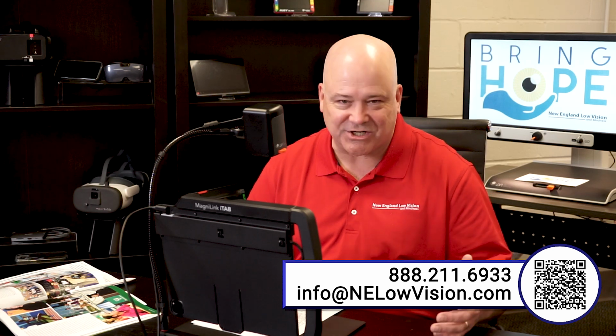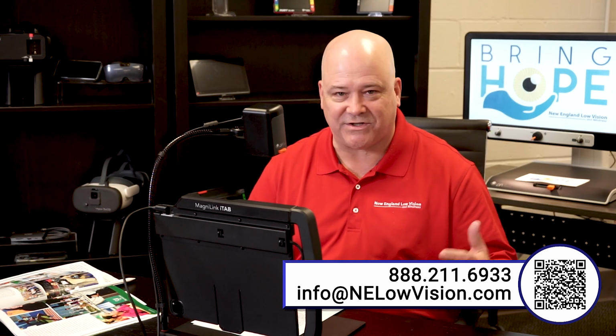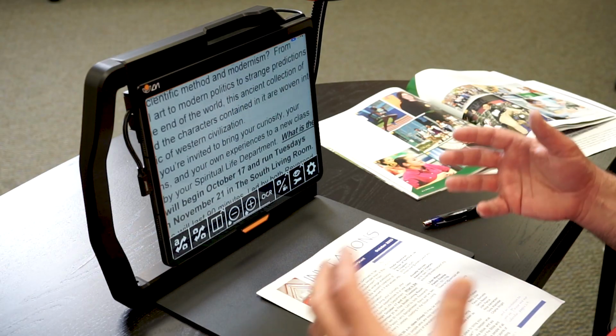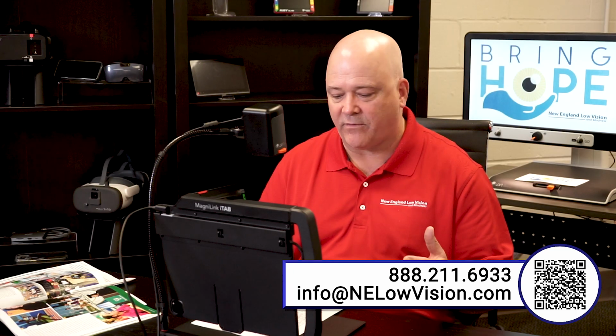So these gestures, and there are a number of them, come very intuitively once you start using the device. Of course, like anything, you have to learn the gestures, but it takes fairly quick, once or twice or 3 times doing them over and over, where you get the hang of it fairly quick.